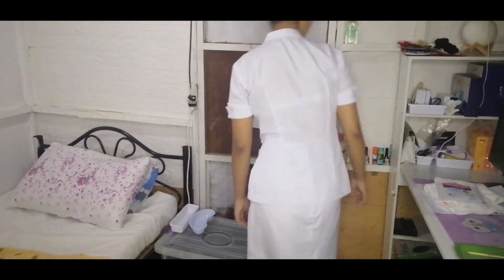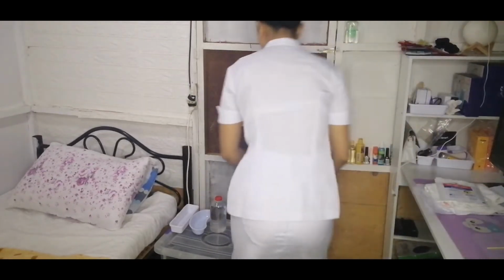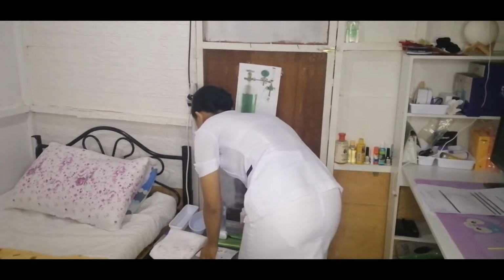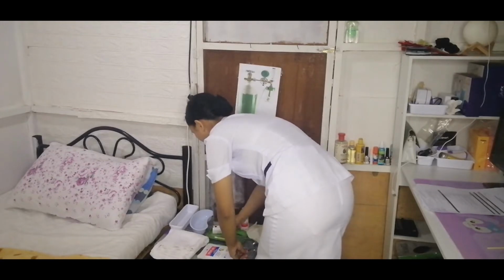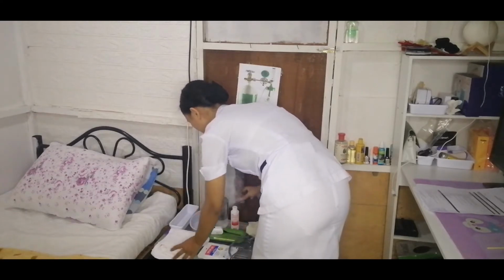Now, let's proceed to the implementation. Bring the necessary equipment to the bedside stand or overbed table. Perform hand hygiene and put on PPE if indicated. Then, identify the patient.